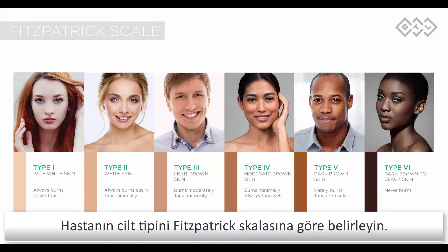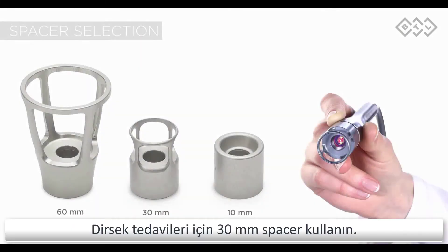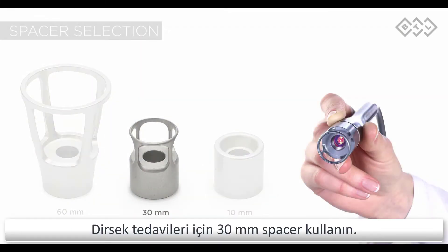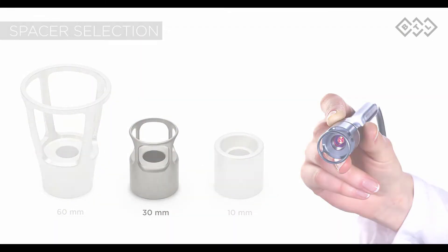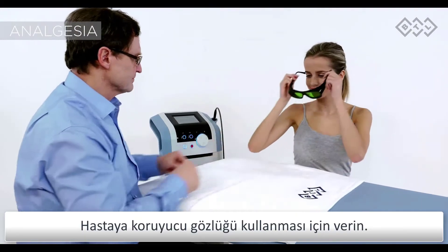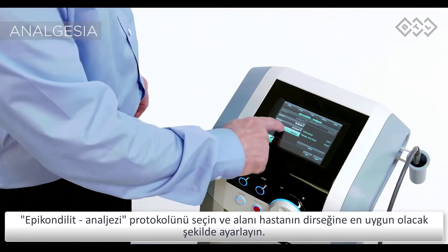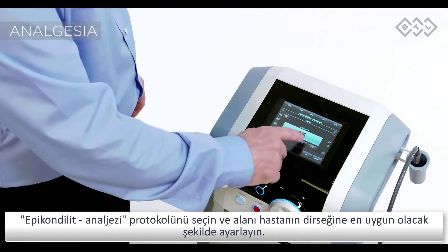Define the patient's skin type according to the Fitzpatrick scale. For types 4 to 6, see the general guide. For treatment of the elbow, use the 30mm spacer. Hand the patient the protective eyewear. Select the epicondylitis analgesia protocol and adjust the area to fit the patient's elbow.